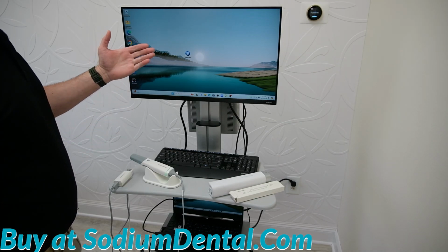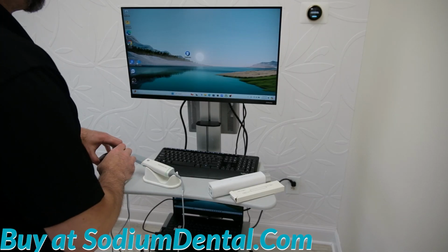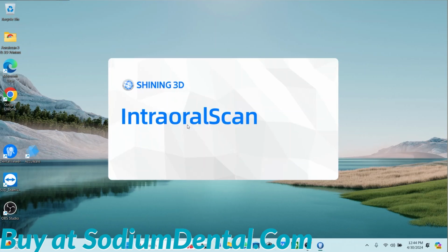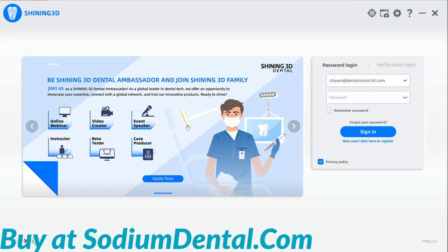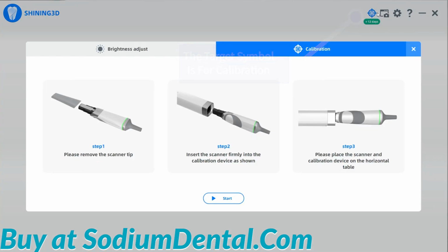Now, first steps. If you've already installed your dental launcher software, double click it here. Intraoral Scan is the name of the software you will use to scan with your Shining scanner. One of the first things you want to do with a new scanner is calibrate the scanner.